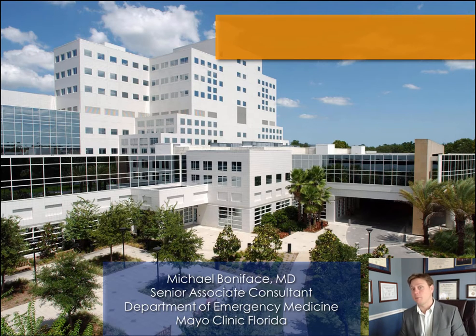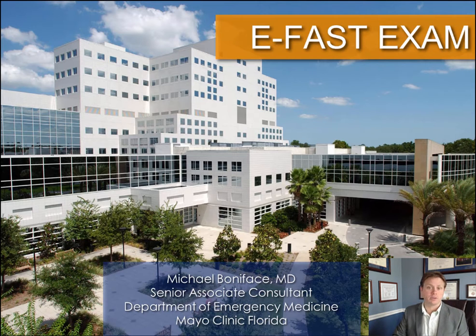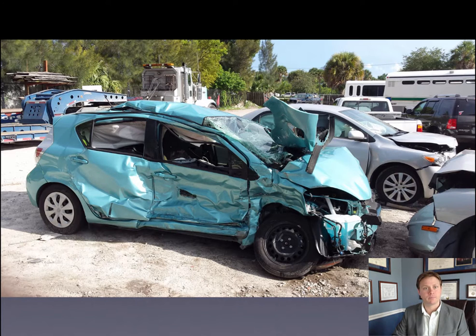But as you'll see, despite its original application for trauma patients, the concept behind the FAST examination can be applied to a much broader population of patients in a variety of clinical settings. The E, prior to the FAST examination, designates an extended FAST exam, looking at thoracic windows in addition to its originally described windows. So I'd like to get started by showing you this photograph.